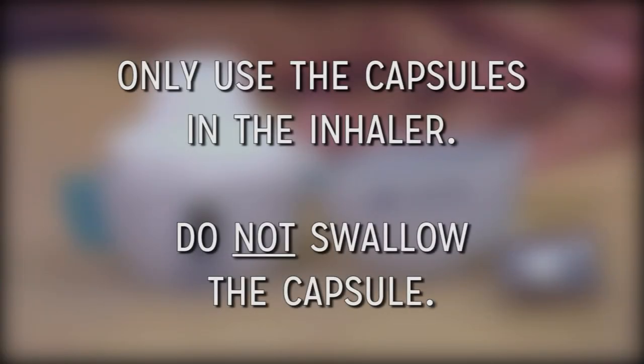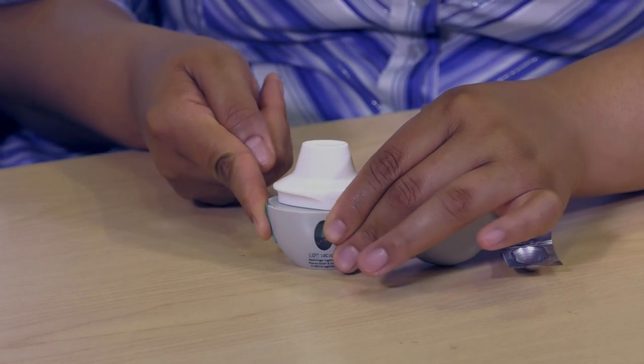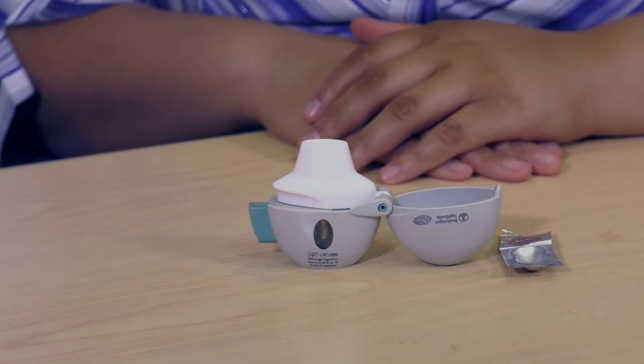Only use the capsules in the inhaler. Do not swallow the capsule. Press the green piercing button once until it is flat or flush against the base, then release. This makes a hole in the capsule to allow medication to come out when you breathe in.